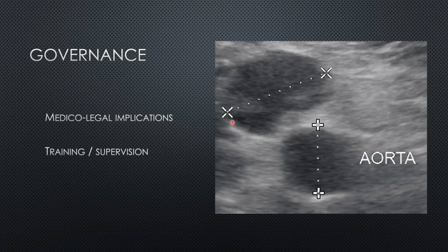So in this patient, I actually initially thought this was the IVC with some clot within it, but this is actually a massive para-aortic lymph node. So just be aware that there are some false positives and false negatives and a few traps with DVT scanning.